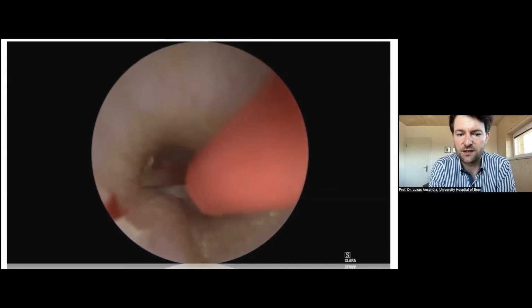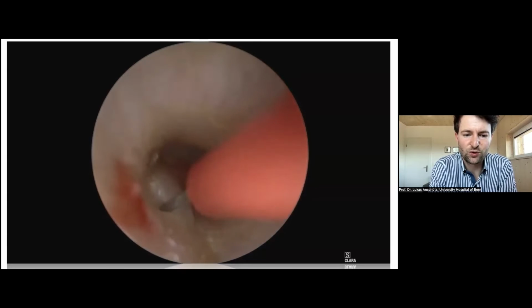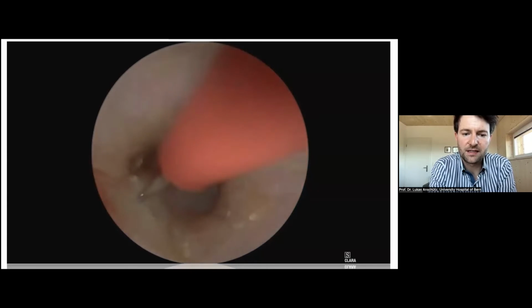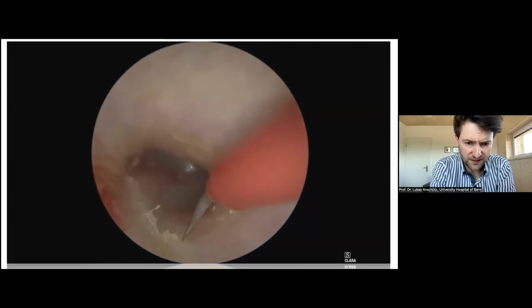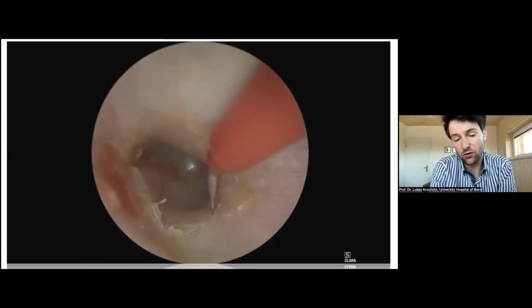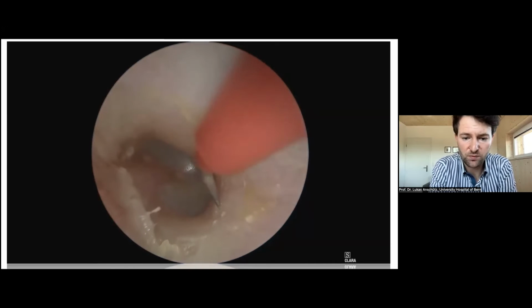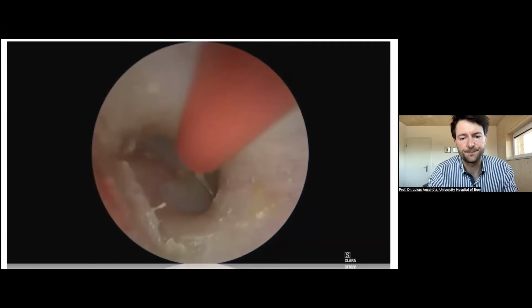And you can see it was in the time where I still had my needles to do the flap delimitation using the monopolar. It is a really nice tool, but as you saw, it's not absolutely necessary. And also there is some related cost because this tool, of course, is disposable.